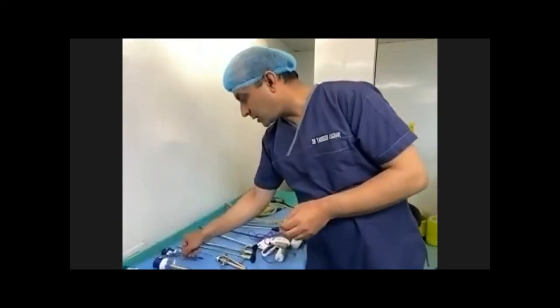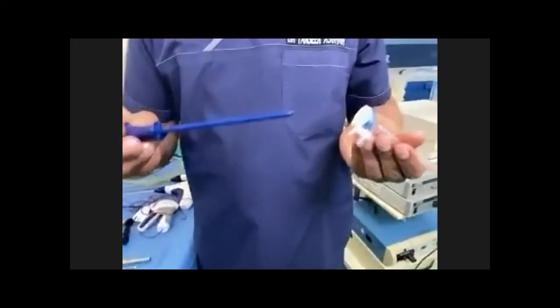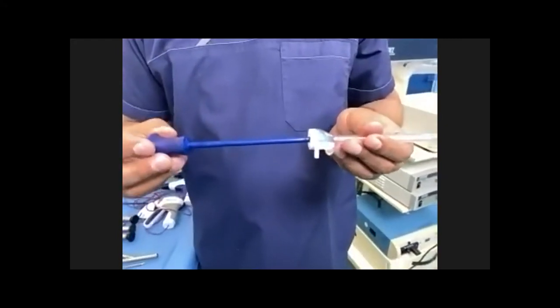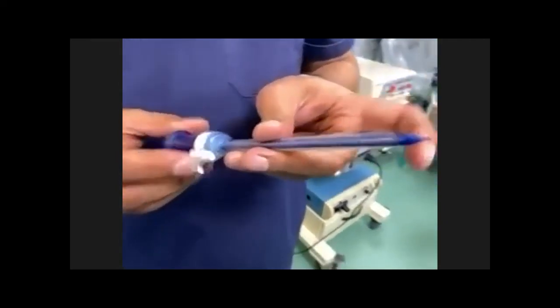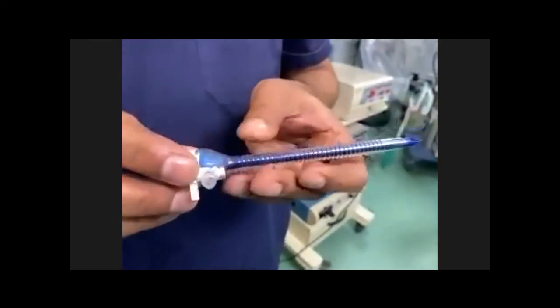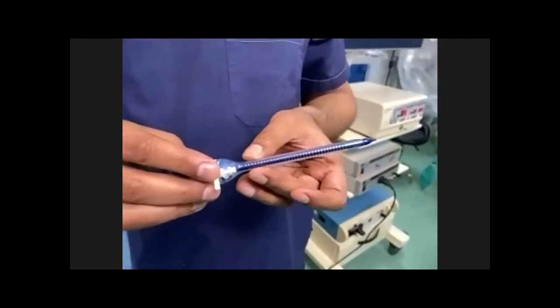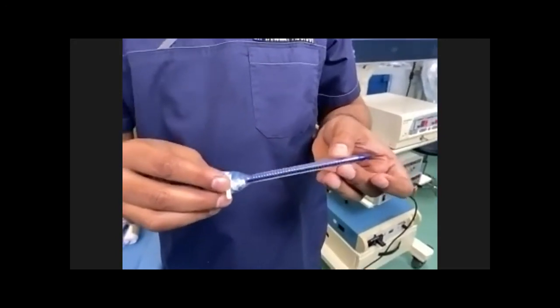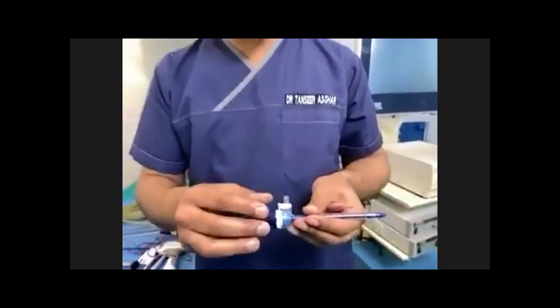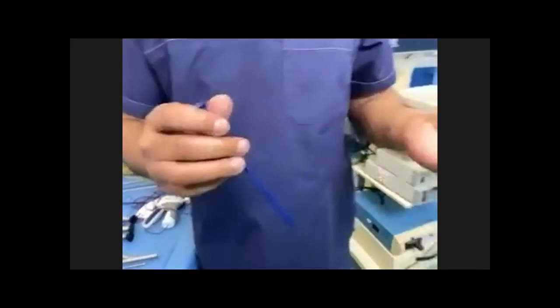So in the disposable ones, there are also trocars which are 5 millimeter, and they have almost the same mechanism, and it is a pyramidal shape trocar tip. The port's cannula has ridges, and it is 5 mm in diameter and about 13 to 15 centimeters in length. Different companies make different lengths. There is a valve as well, and you can see the entry point as well.